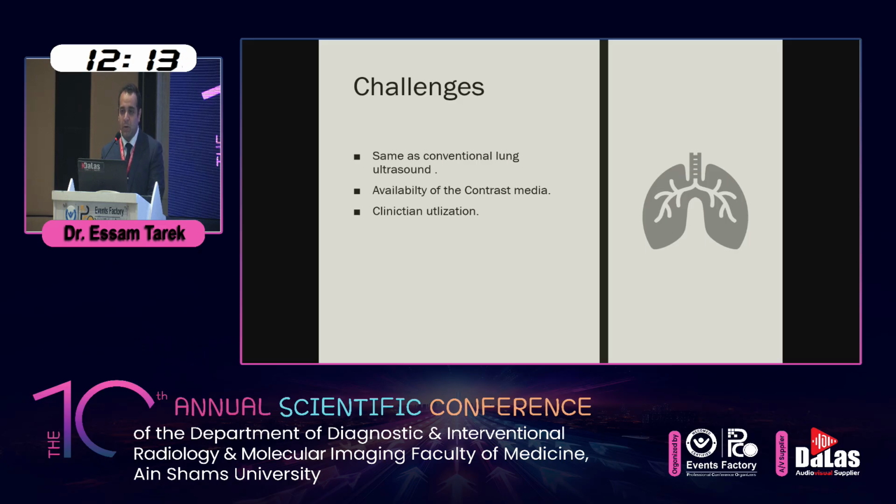Unfortunately, for now, I'm not talking globally, I'm talking especially about Egypt: the contrast media that we use in contrast enhanced ultrasound, especially in the lung, is not that globally available. It is still available in Egypt in some hospitals, but not globally, so we need to investigate more for such a reason. Also, as we have a chest doctor here, we are asked for clinician adoption of this system. From our end, we need more training and more experience on these topics.